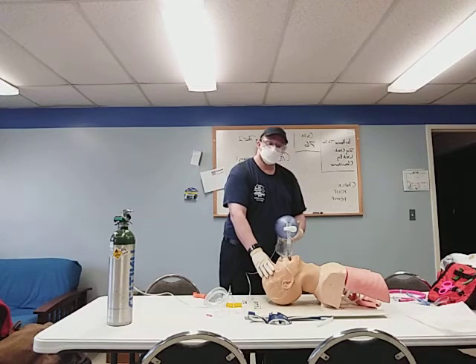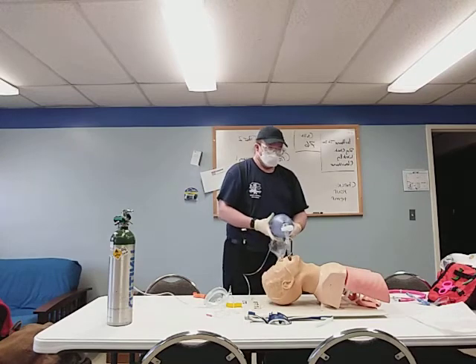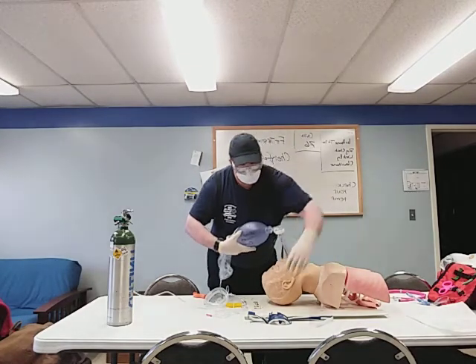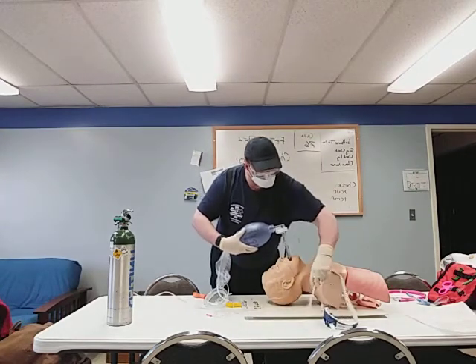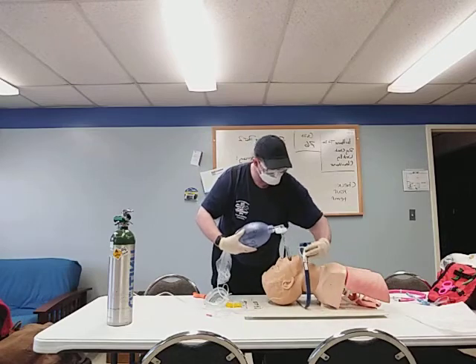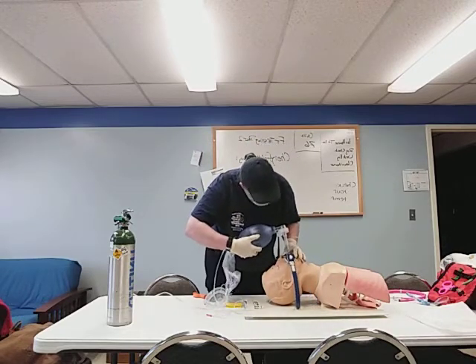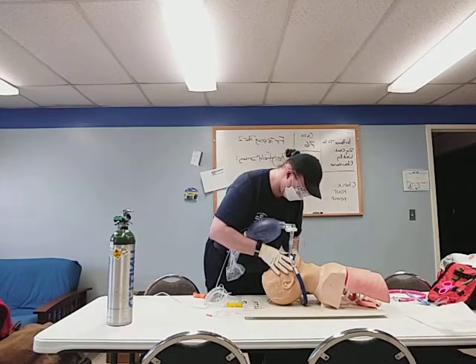Next, I need to secure the tube. I would like to ask my assistant to help, but if I'm alone, I'll have to do this on my own. Make sure to not hyperventilate or hypoventilate.